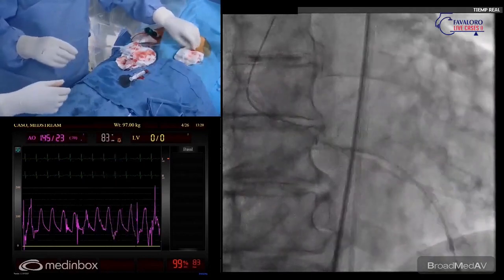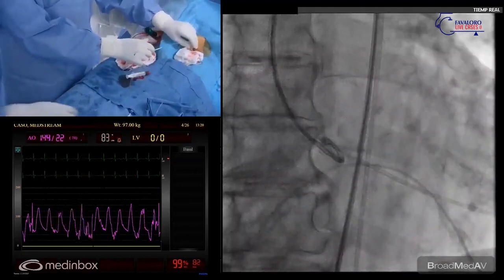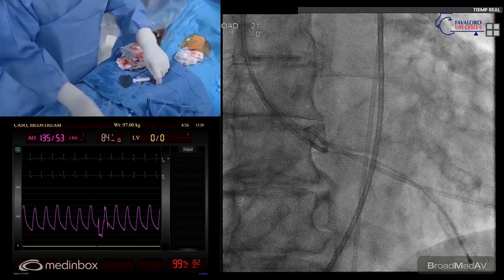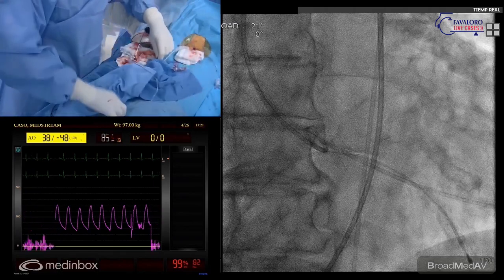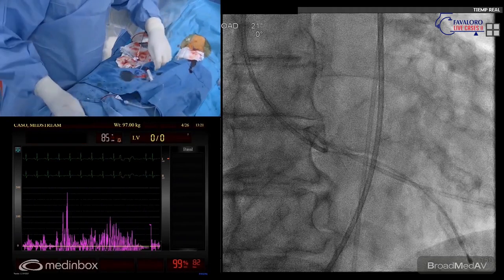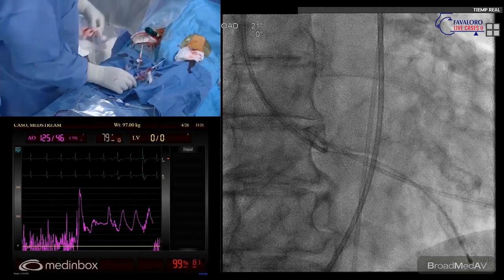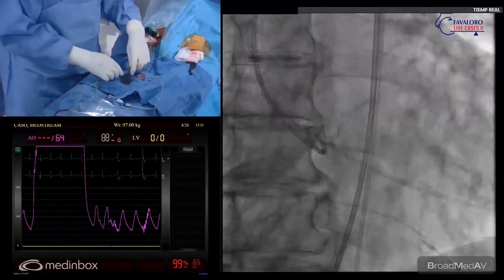So the health insurance sends the device that you have to use. If you want to change it, you can't, or you have to do a long errand. So you have to balance how much time you have to wait and how much different your selection would be. Exactly. The advantage of the balloon expandable valve is the rate of pacemaker. That helps us discharge the patient the next day in the majority of cases, although in some cases we can discharge the patient the same day. In that way, it also reduces hospitalization.